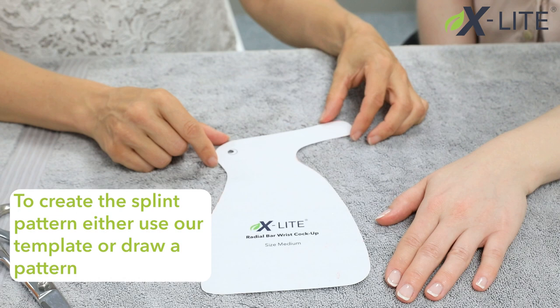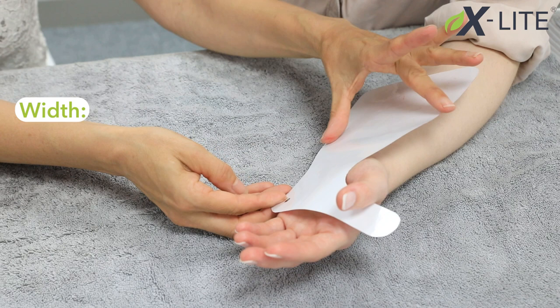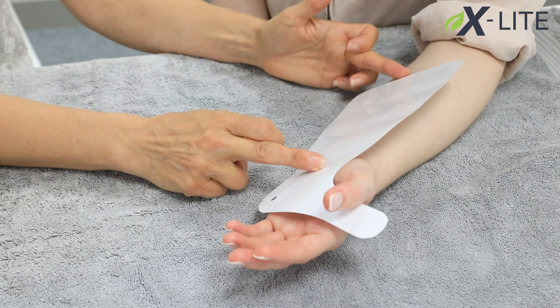To size the patient, ensure the distal edge of the pattern is below the distal palmar crease. For the width, the forearm should be half the circumference, and the length should be two-thirds of the forearm. This can be used volarly or dorsally.